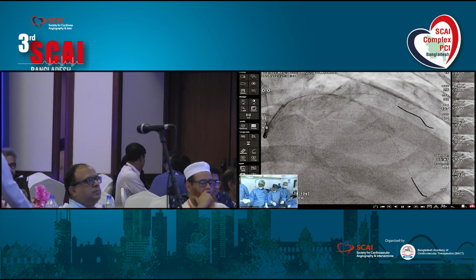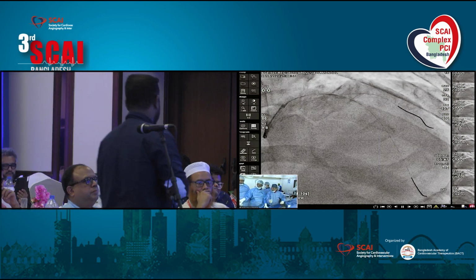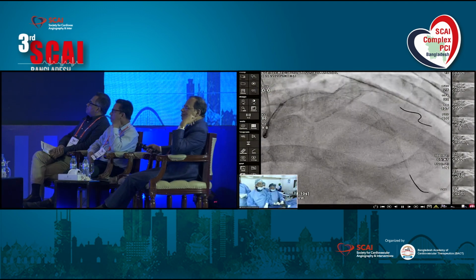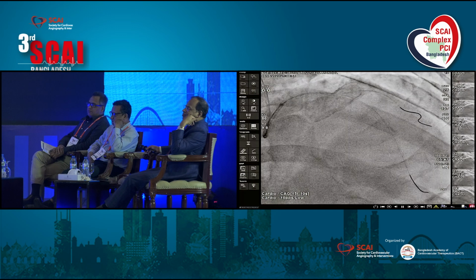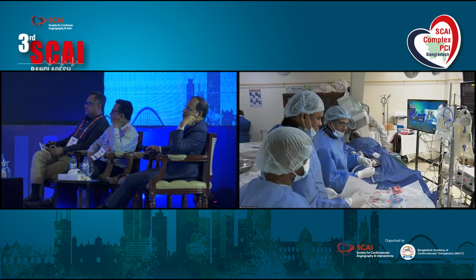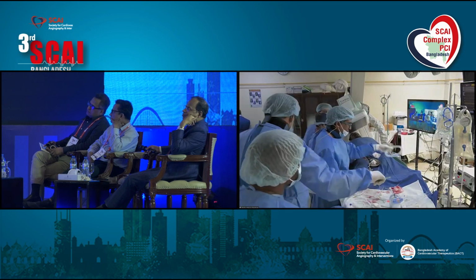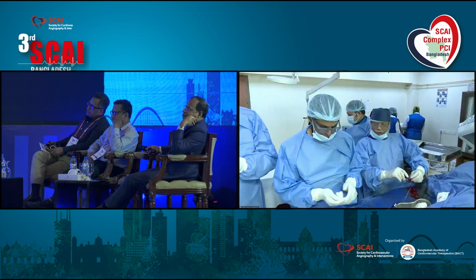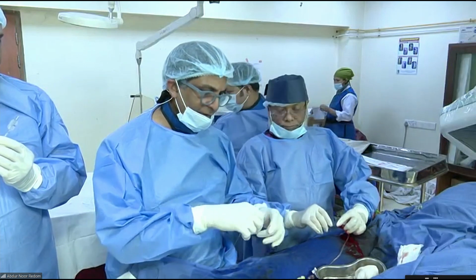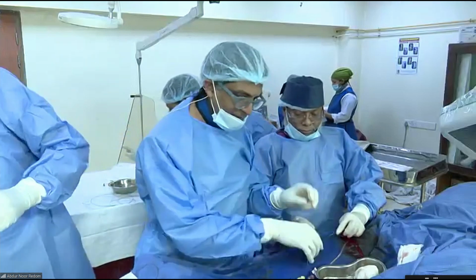So, Dr. Guzman, how would you like to treat this patient regarding the diagonal and the main vessel lesion? We are going with a 3 into 38 Synergy. In my opinion, we have to prepare the lesion better and see the result. According to the result, because you have DCB available, I would probably go in that direction. If there is not an appropriate response, I would put a stent. I would not treat the diagonal. I would forget about the diagonal. If you want to put a wire, it's okay, but I would not treat the diagonal. Yeah, agreed. We are not treating the diagonal. I fully agree with you.